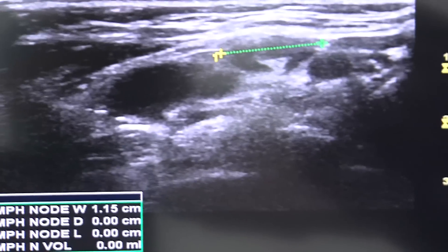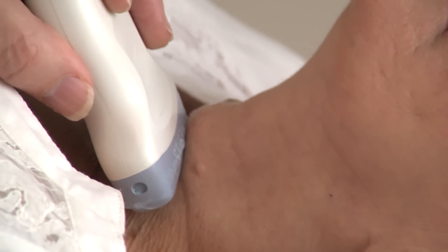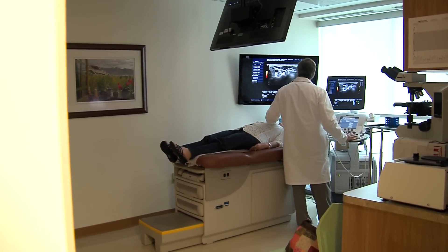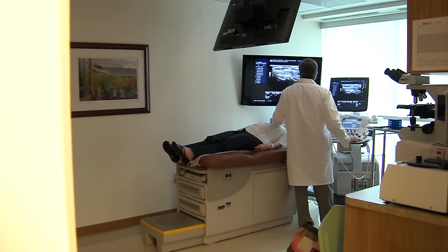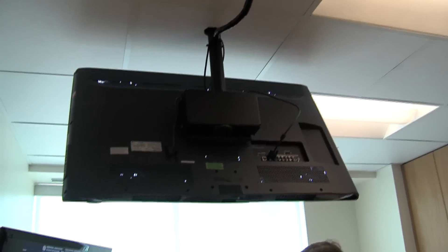I'll measure its length, its width, and its depth. And here is your nodule — now we're getting over on the left side and looking at your nodule. I understand now why I didn't really feel it that well, because it's on the back side of the thyroid gland. But your nodule is big enough to where we probably ought to sample it — that means doing a biopsy. If you'd like to, you'll be able to see the needle go into the nodule on the screen. If you don't want to look, that's totally okay.